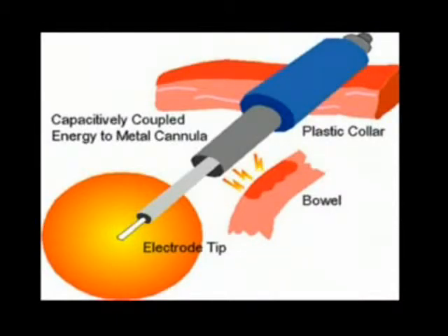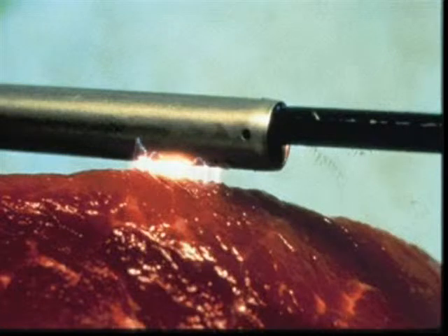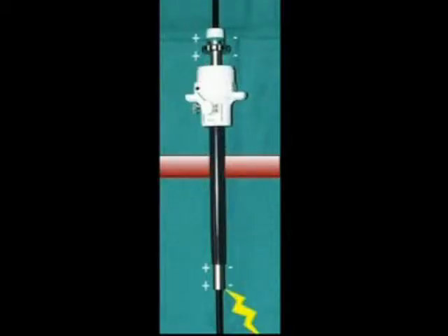It occurs when a metal port is held in place by a plastic anchor or olive, as illustrated here. Once again, the metal port creates a capacitor with the active electrode, but this time the plastic anchor insulates it from the abdominal wall. This insulation prevents the current dissipating through the relatively large surface area of the abdominal wall, and thus capacitively coupled current may exit to adjacent tissue in the abdomen on its way to the patient return electrode. This has the potential to cause significant injury to the patient. Another scenario which must be avoided, not only because it is dangerous but also unnecessary, is where a metal reducer tube is inserted inside a plastic port.